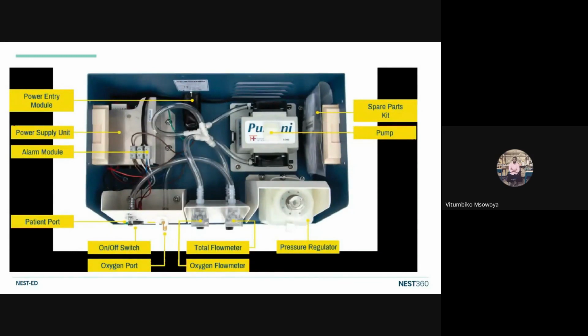At the end of this magnetic rod, between these two coils, we have two diaphragms. When one coil is de-energized, the other one is energized. We all appreciate in engineering that when a coil has been energized, it temporarily has an electromagnetic effect. So with that, that diaphragm will be reciprocating, pumping air outside the system.